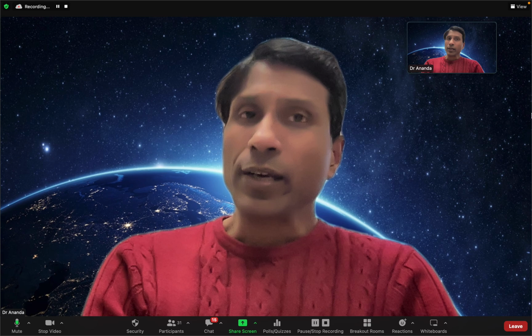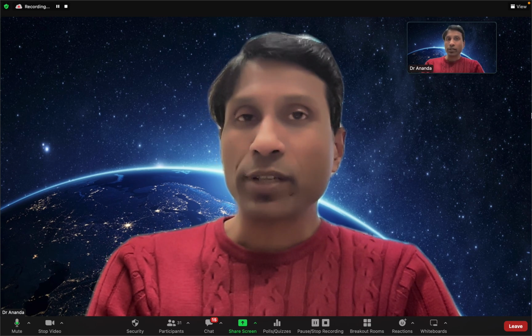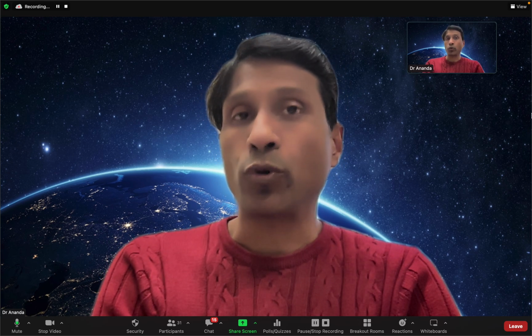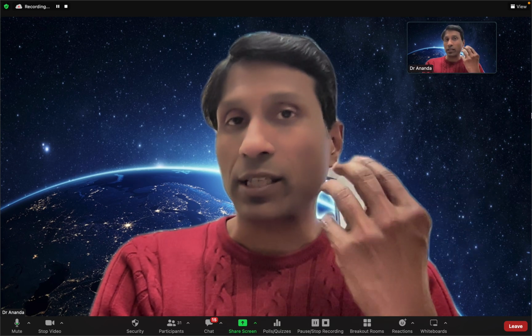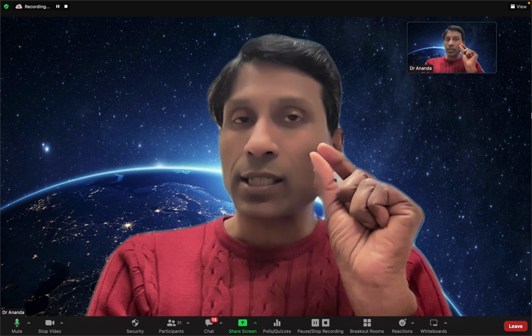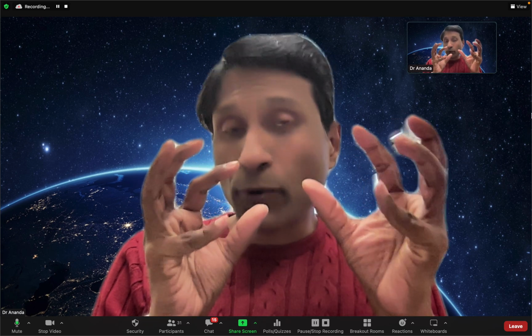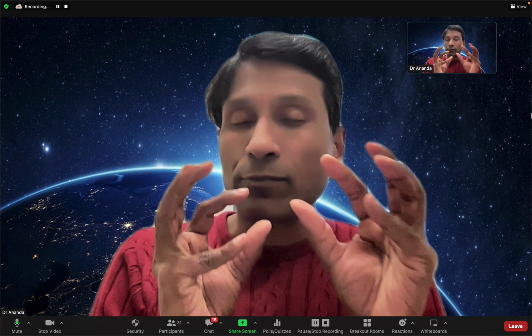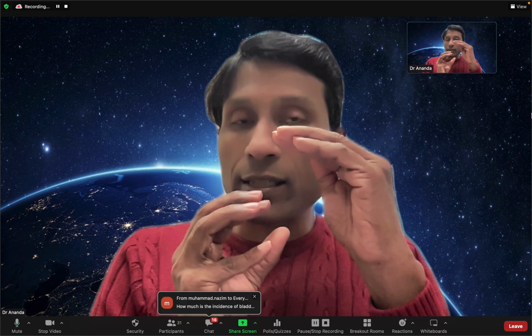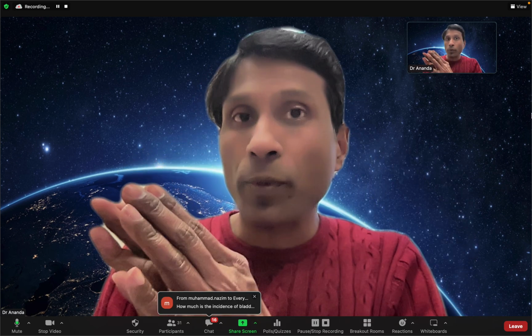Yeah, I will quite heavily rely on how the patient feels. At the end of the day, if the patient feels, doctor, my waterworks are fine, I can see the improvement compared to pre-Rezum or pre-Urolift, that is my main target to achieve. Sometimes Rezum, as I said, causes that prostatic swelling, which is supposed to be temporary, only 3 to 5 days. But that swelling could be the reason why the Qmax is not good enough. But that Qmax may not be an actual reflection of the patient's voiding in his home environment.